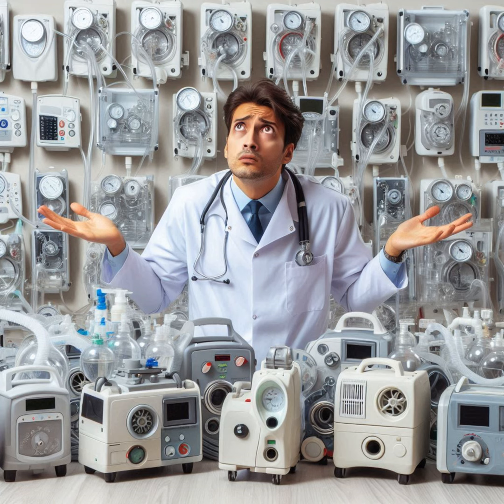This article also talks about something called trans-alveolar mechanical power, which is basically the energy transferred from the ventilator to the alveoli themselves. Right, and studies have shown that too much of this mechanical power can contribute to lung injury. So if we can accurately measure this power, we could adjust the ventilator to keep it within a safe range, which is amazing when you consider how much we're learning about protecting the lungs from the inside out.